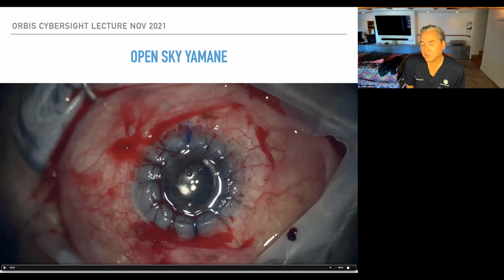The main reason you don't have to is because, number one, most of these cataracts are very dense. They're like mature cataracts, so they don't have a lot of cortical material. Number two, you can blow a lot of it out just with BSS. Trying to get a Simcoe or an I/A, a Simcoe works better, but oftentimes you end up pulling on the anterior capsule where you were doing the capsulotomy, and it just creates kind of a headache, and it's nerve-wracking. If you can clear the central back of the capsule with a Weck-Cel, or even the Weck-Cel, sometimes the cortical material will stick to it and you can pull it. Those are fine because the cortical material will dissolve on its own.